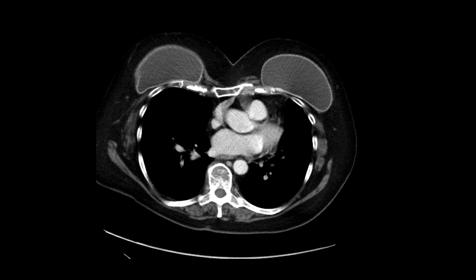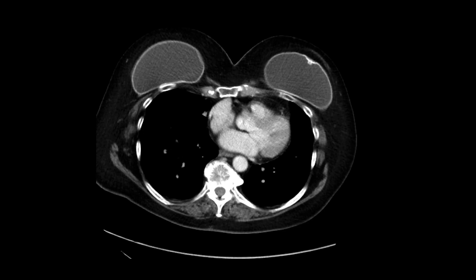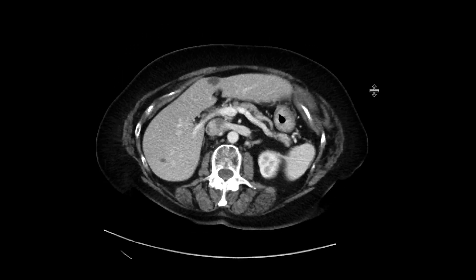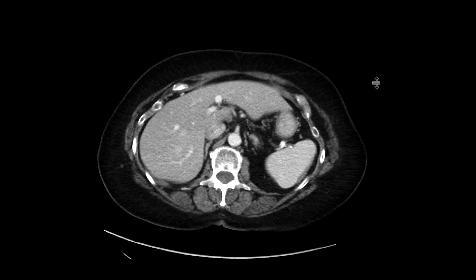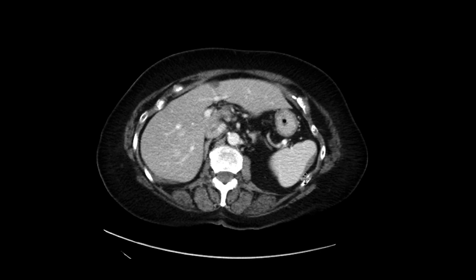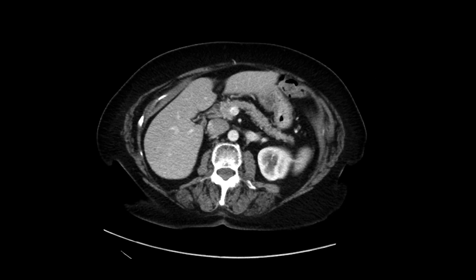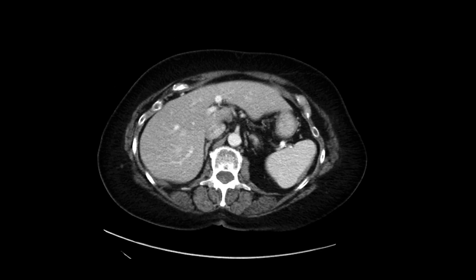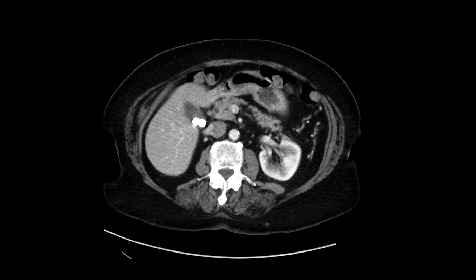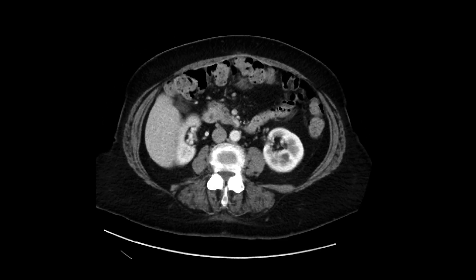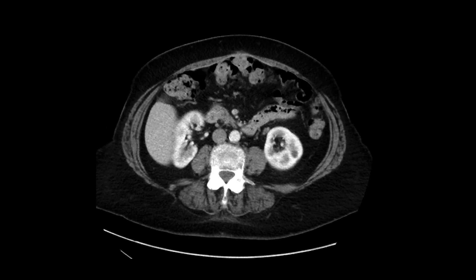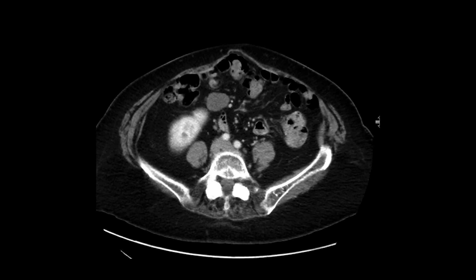This is a patient with ovarian cancer who comes in for restaging, and we do a CT scan with intravenous contrast. As we go through it, there are a few things to point out. We can see that surrounding the spleen there's a little bit of tissue surrounding it. There are a few too-small-to-characterize things in the liver, and some of these are cysts. There are some gallstones, and similar too-small-to-characterize things in the kidneys, as well as renal cysts.